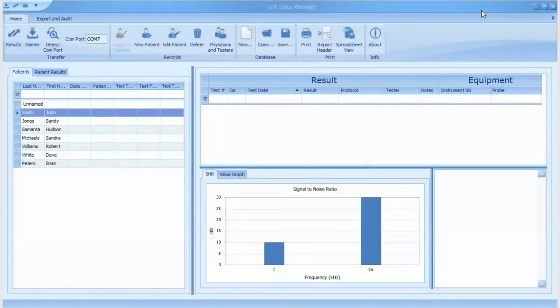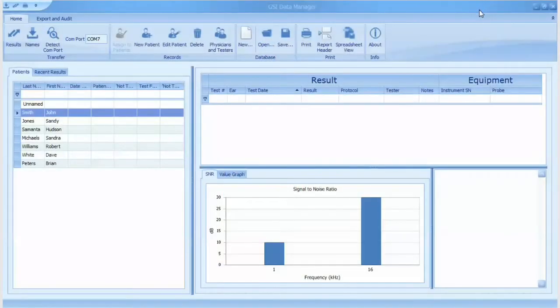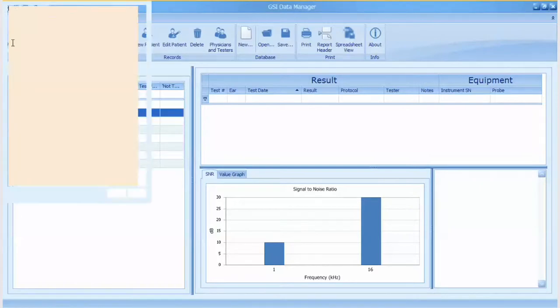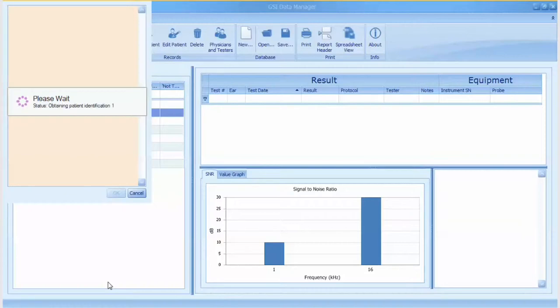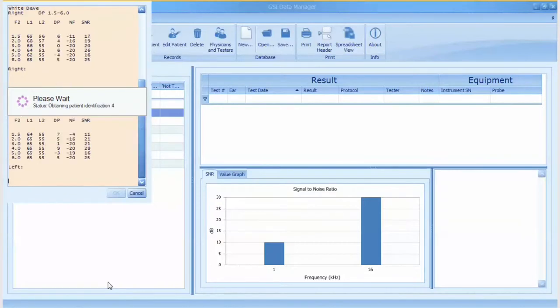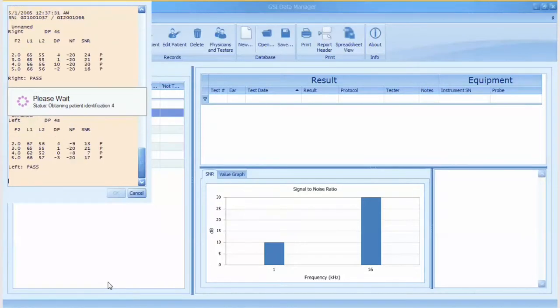Click on the results icon to initiate the transfer of all the OAE test results stored on the CORDI to the data manager. Click OK when the data transfer is complete.